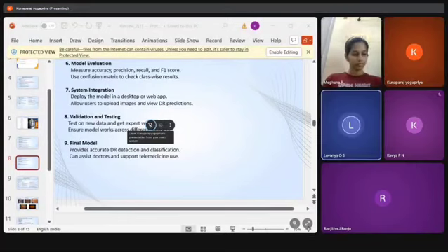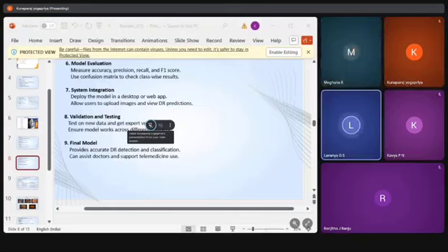Our system design consists of several modules, ma'am, starting from data acquisition and pre-processing to feature extraction, classification, and final result display. The CNN model automatically extracts the important retinal features and classifies the image into one of the 5 DR stages, ma'am. Finally, the Flask-based interface makes it easy for users to upload an image and view the result instantly, ma'am.